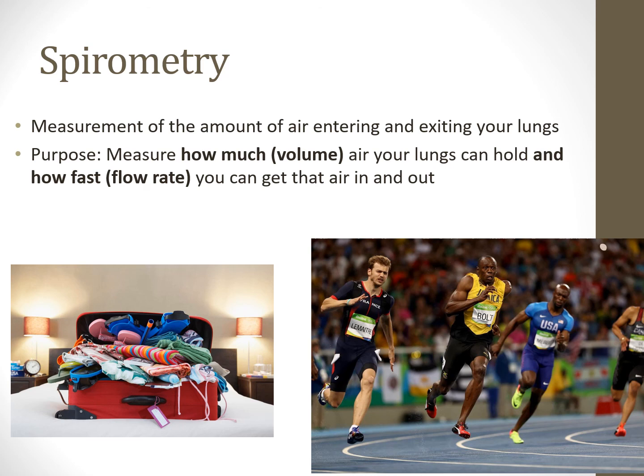Spirometry. Spirometry is the measurement of the amount of air entering and exiting your lungs, right? So we're measuring the air. And the two things that we're looking at with bedside spirometry, so this is what they might call it in the hospital, bedside spirometry, right?